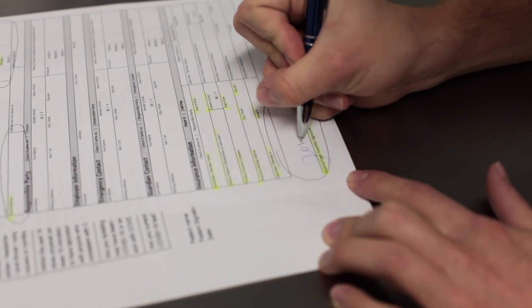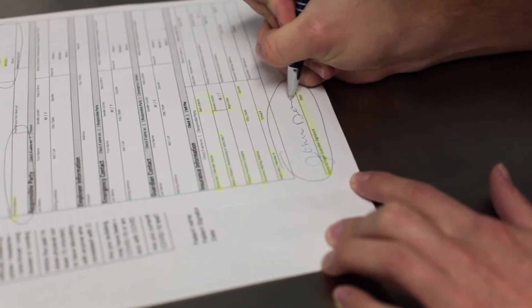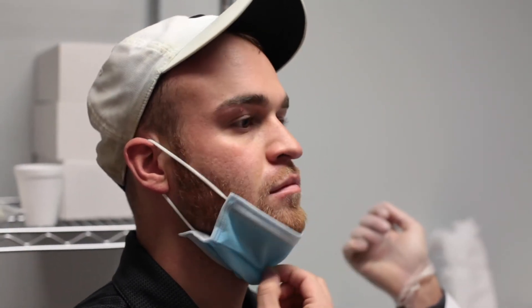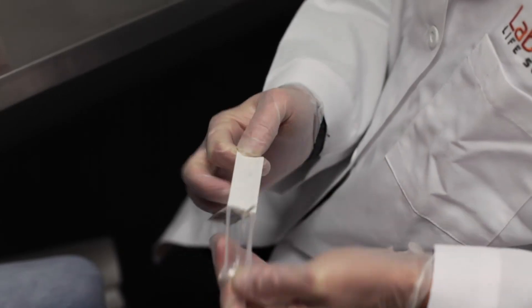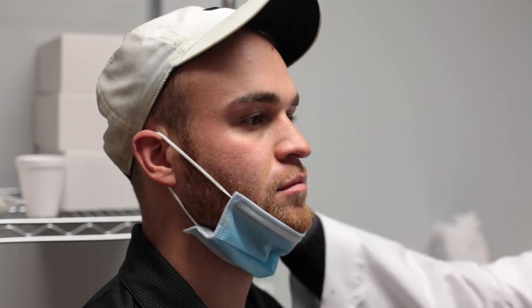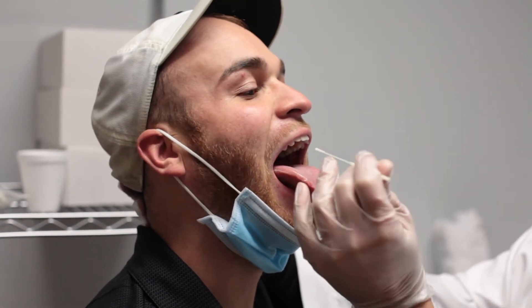To begin, make sure the patient has completely filled out all necessary forms. Have the patient facing a strong light to ensure the area to be swabbed is visible. Carefully open your swab and remove it from the package. Have the patient tilt their head backwards, open their mouth, and stick out their tongue.